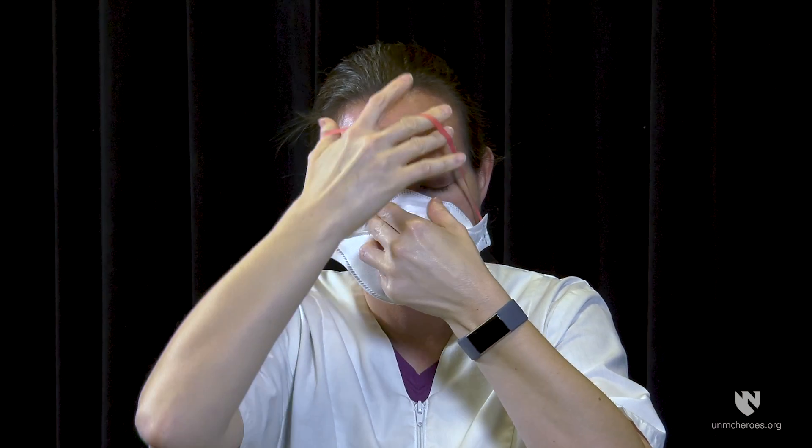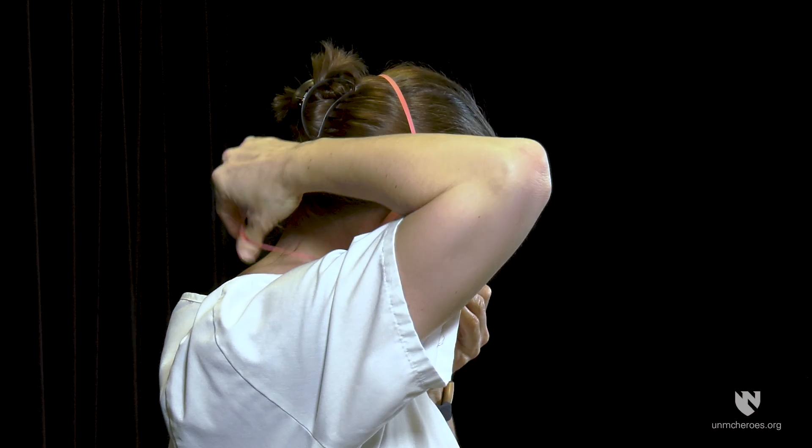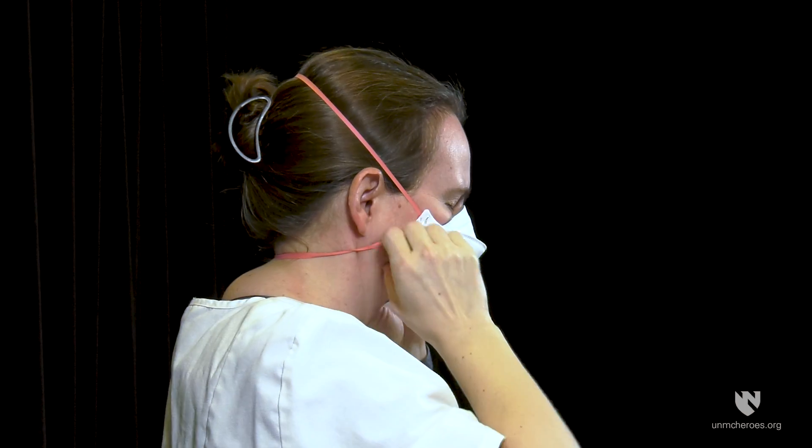Pull the top strap over your head and position it at the crown of the head. Remove any twists in the straps. Pull the bottom strap over your head and position it around the nape of your neck. Remove any twists in the straps.